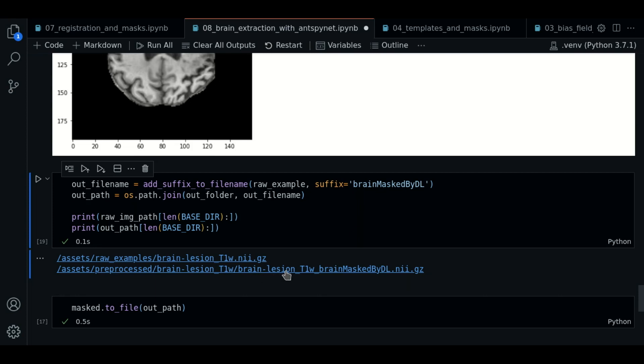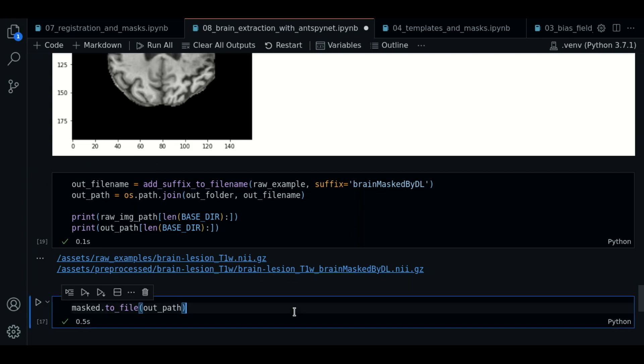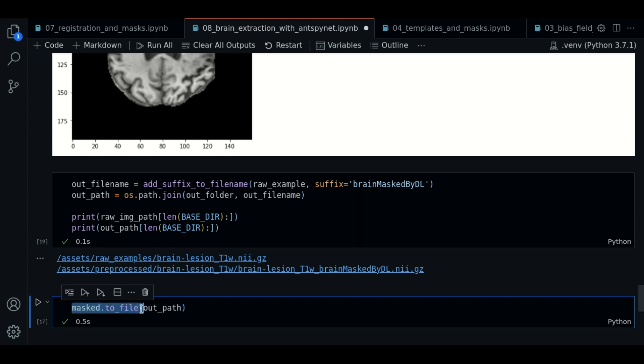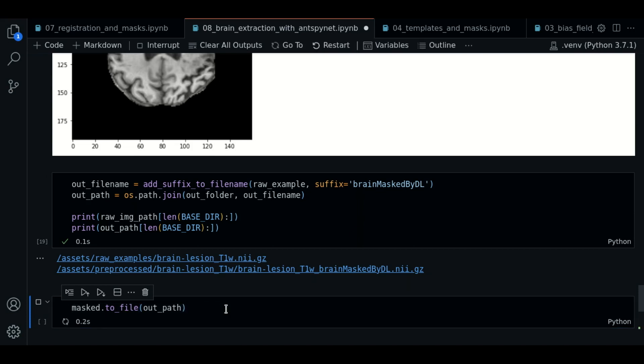So here's where the result is saved. As you can see, we call the to file method, we execute, and now the result is saved.